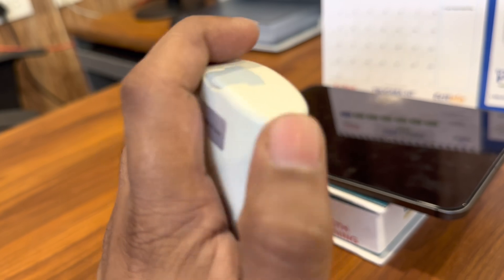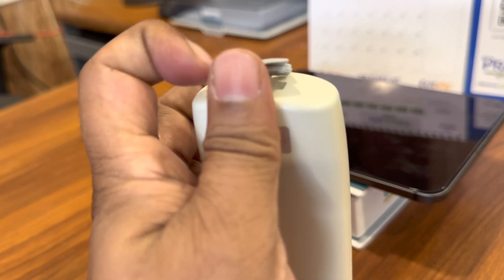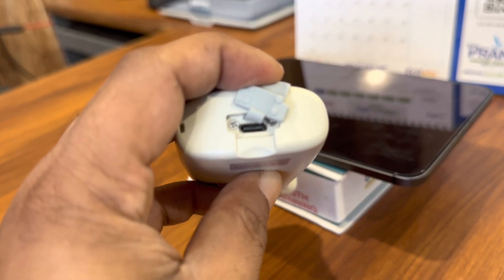It comes with a rechargeable lithium-ion battery and you can recharge the device with a Type-C USB cable.